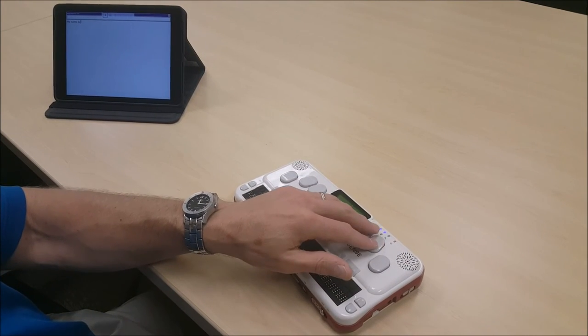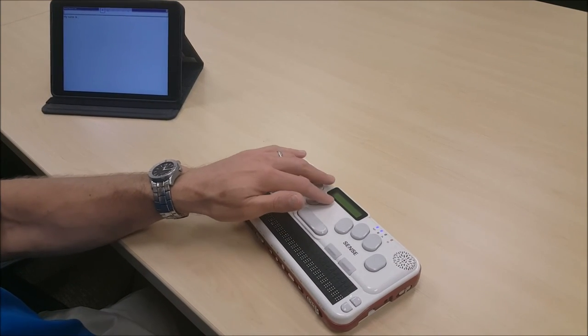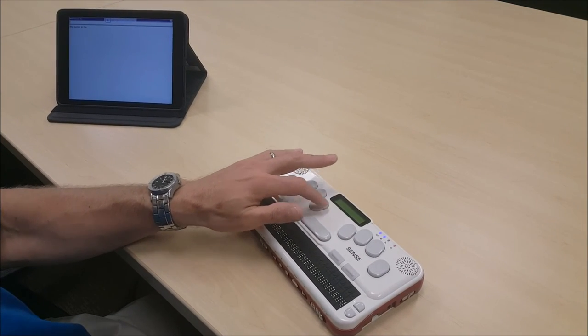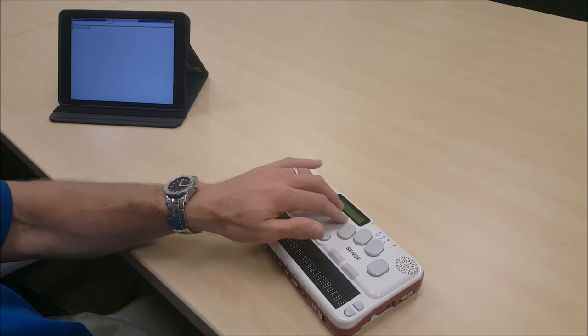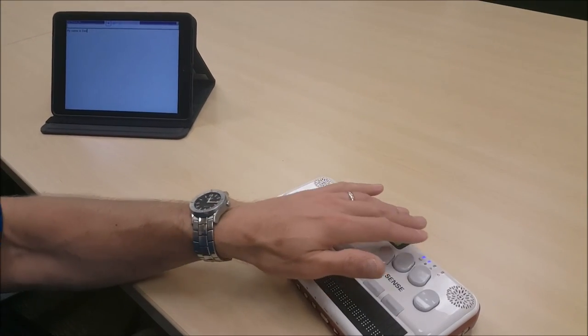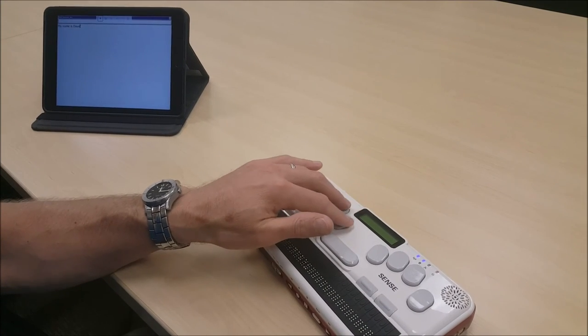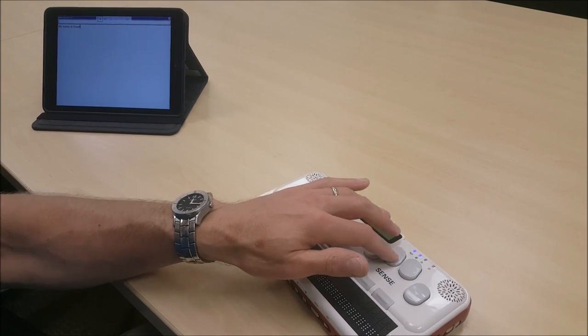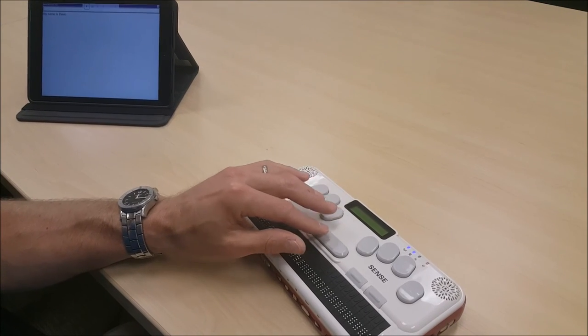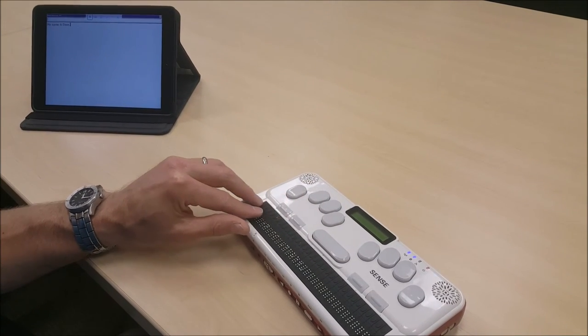Now we'll finish it with Dave, and we'll hit dot 6, space. D, A, V, E. And in case there are grammarians watching, we'll put a period. Now we have my name is Dave.